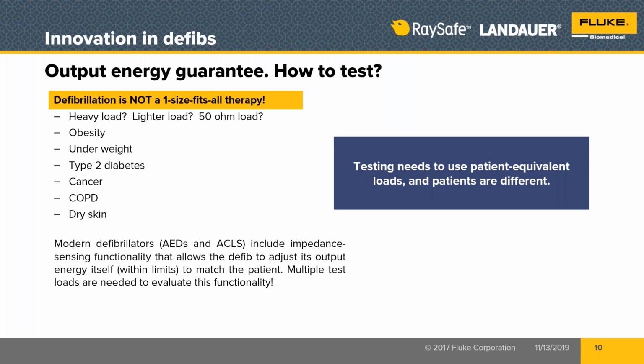Those tests are done for sure, but they're not done by the biomed typically. They're done by nursing, or in the case, Justin, of ambulance services and air medevac, they're done by a flight engineer or someone on a daily routine. But typically those would be done by the clinical staff. The twice per year is what the biomed is going to do.